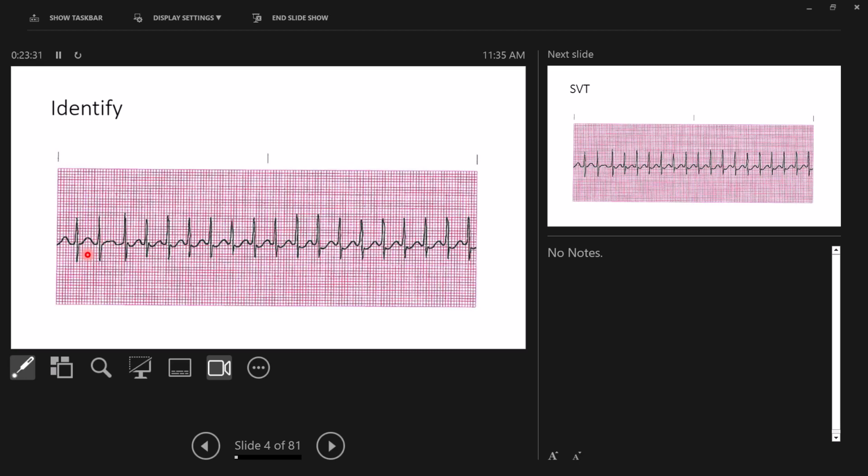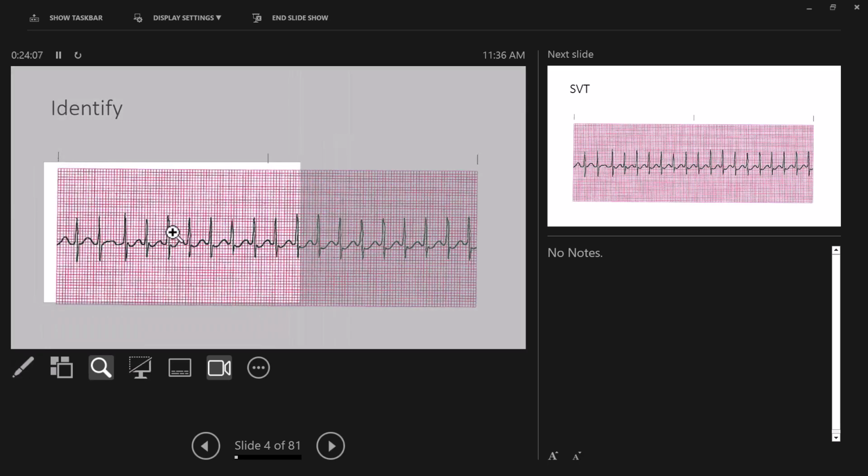The ventricular repolarization. Remember, size matters. The ventricles are much larger than the atria, and the left ventricle in particular makes up about 75% of the heart. And so that's why we're seeing those larger waveforms in there, okay? So we don't really see P waves, therefore we can't really identify what? No PR interval, okay? So now, what do you notice about the width of the QRS?